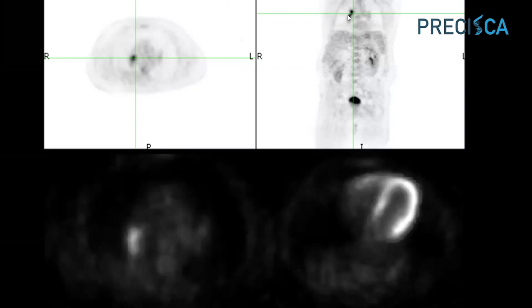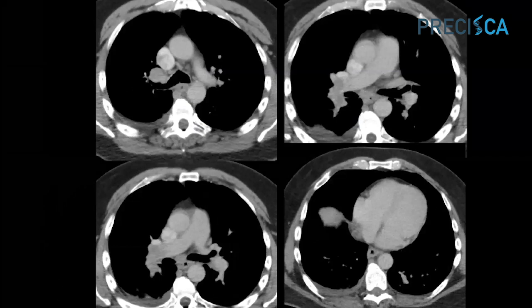but you can see that there's increased uptake. A bland embolism should not have increased uptake. And so if you see that uptake within the embolism, it suggests that it's a tumor origin, potentially. Very rarely, histoplasmosis or some fungal infections can involve the pulmonary artery and can have uptake. But in the right setting, it becomes very concerning that this is metastatic disease. Another option, of course, is MRI, that increasingly MRI with contrast can be very useful as well.